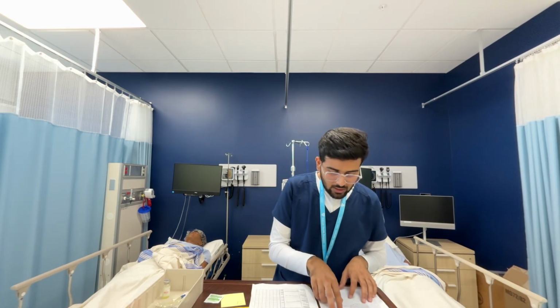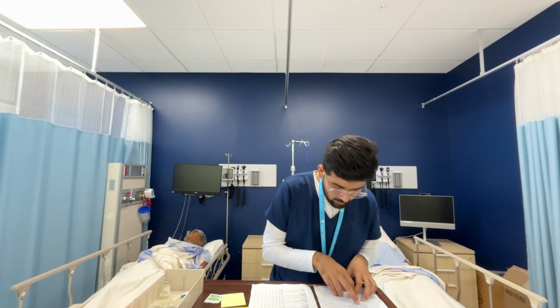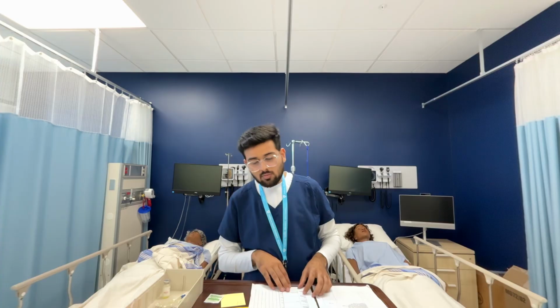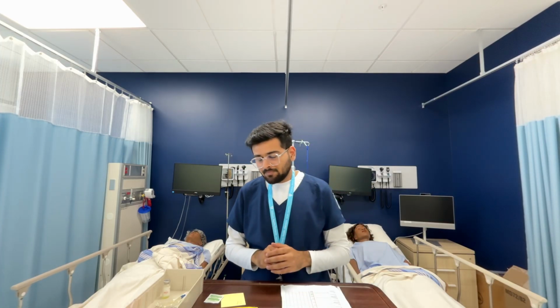Patient has no known drug allergies, and I'm giving pantoprazole 80 mg through IV. I'm done with my verification check.